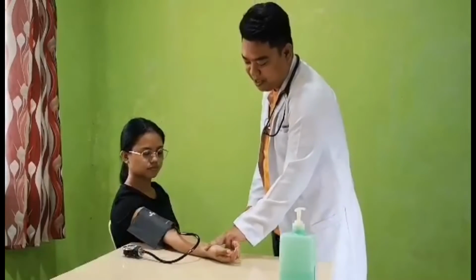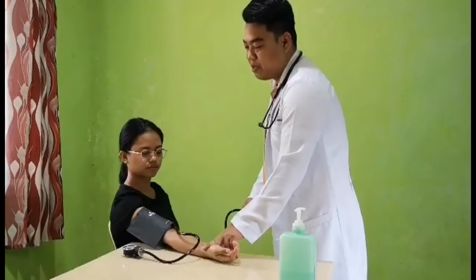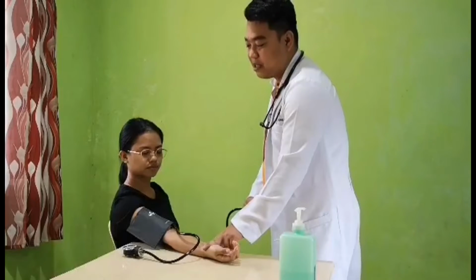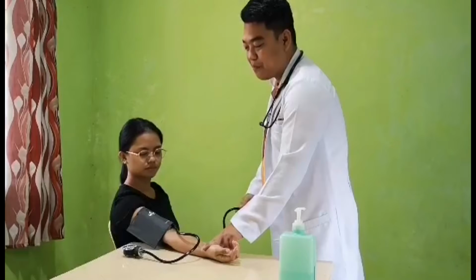After palpating the radial pulse, inflate the BP cuff with an increment of 10 to 15 millimeters of mercury, and take note of when the pulsations disappear. When the pulsations disappear, that is the time that you can document that as the approximate systolic BP of your patient.